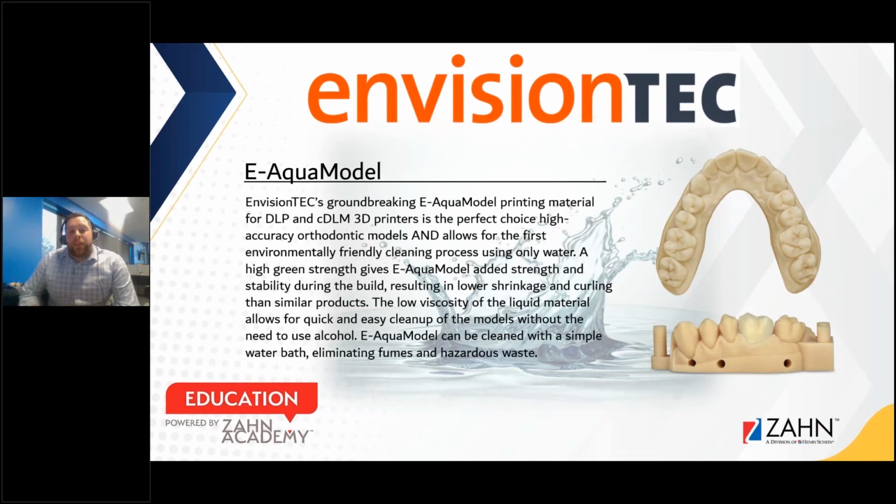And that's huge, because typically with resin printers you have to utilize an IPA-style alcohol to rid the model of excess material, any uncured resins sticking to or adhering to the model after the print is cured and finished. So to post-process that, you have to run it through an IPA bath and allow that non-cured resin to be dissolved by the IPA. Well, this eliminates that and allows you to use just water for post-processing, which means it's less caustic. It's not going to be as hazardous.